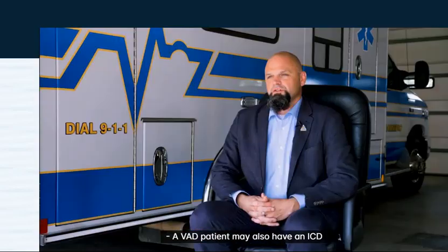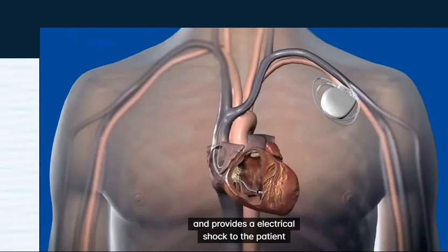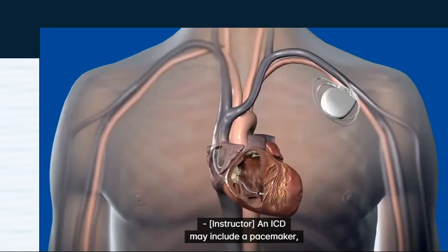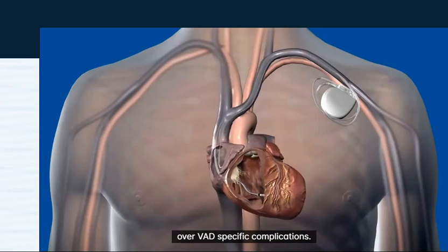A VAD patient may also have an ICD, or internal cardiac defibrillator. This device is separate from the VAD itself and provides an electrical shock to the patient should they go into a lethal dysrhythmia like ventricular tachycardia. An ICD may include a pacemaker, enabling normal heart function with regular electrical impulses. Failure of an ICD or pacemaker device would be a priority over VAD-specific complications.